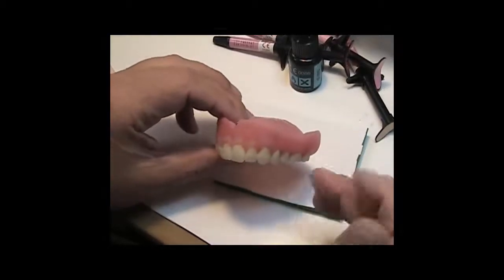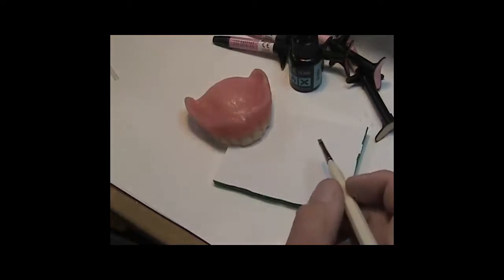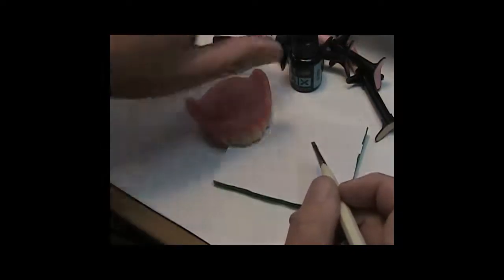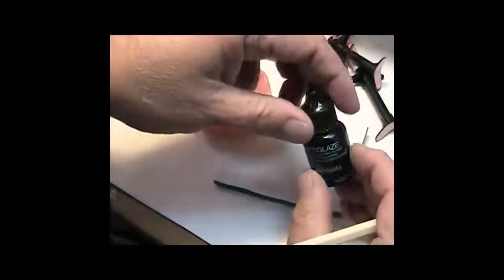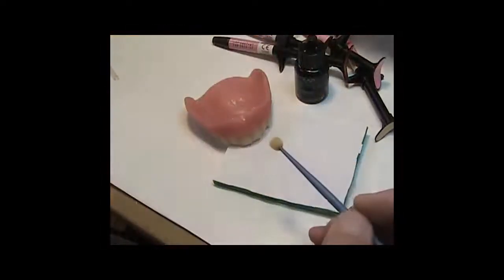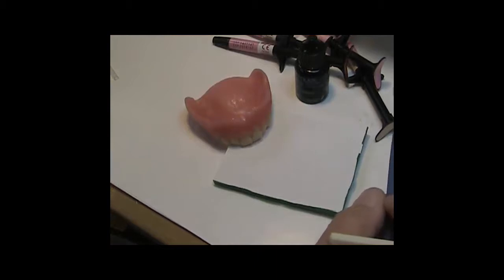So the next step for me is that I have a little technique I call OptiStipple, which is using OptiGlaze, a sponge tip, and some polishing compounds after I've cured it to impart a stippled textured surface.